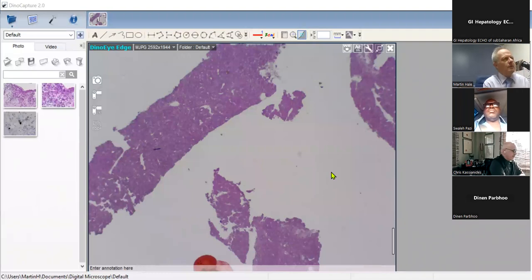So remember, for example, in normal liver, you've got the reticulin framework, the fibrous connective tissue associated with the portal tracts, the central veins, all those structures add, if you like, a foundation to the parenchyma of the liver, and they hold it all together when it's biopsied. But when you have a tumor, often what happens, in fact, is that you get this fragmentation of the biopsy. So that's usually quite a good clue, in fact, that you're dealing with a neoplastic process. It's not always, it's a soft criterion.